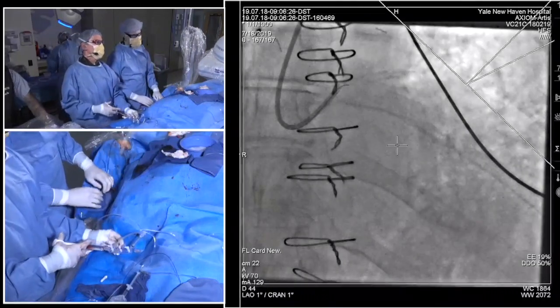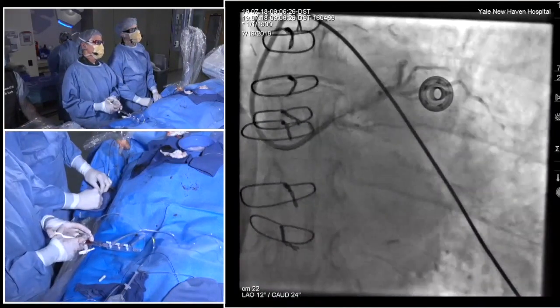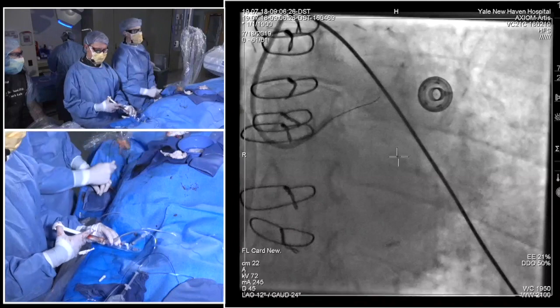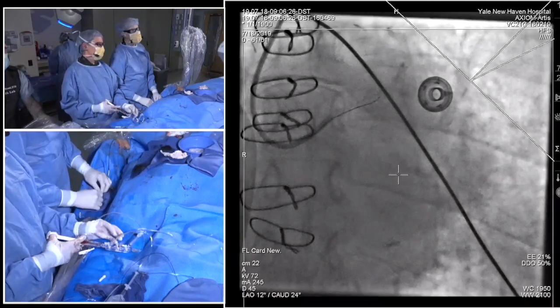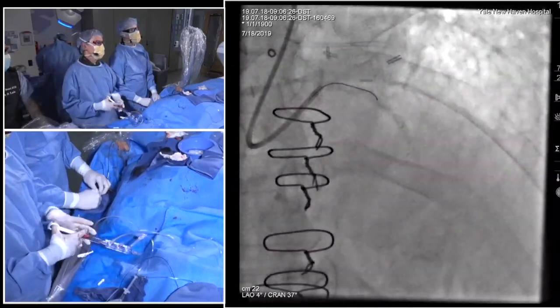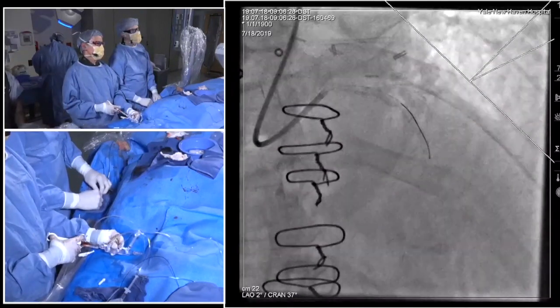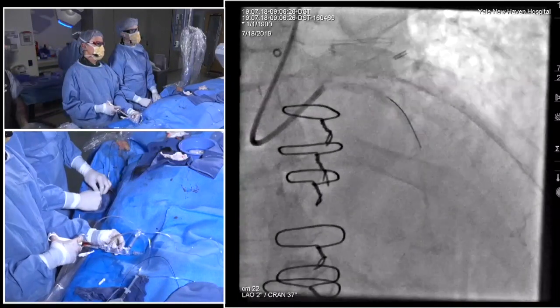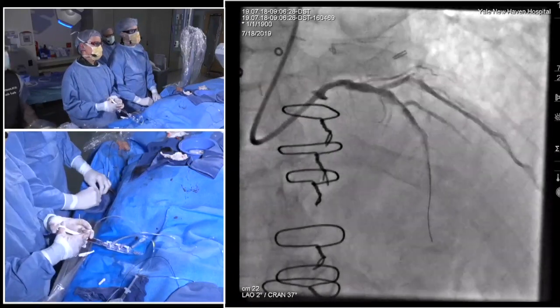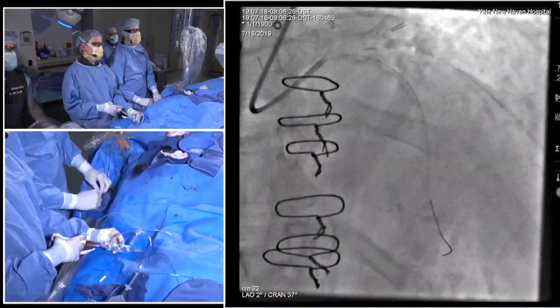So we're with a little wire difficulty. Our plan is to image, and then prior to stenting, we'll wire that diagonal, which was our plan to start with. Some people, just as a point for you guys to talk about, have any of you used a Fine Cross? If you have a true bifurcation lesion, and you want to protect that, have any of you used a Fine Cross in the side branch and wired alongside it? Yeah. So one of the challenges with doing that is you need an 8 French guide to get a Fine Cross next to it.